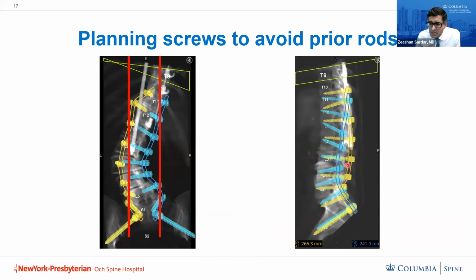That's because obviously there is rotation in the lumbar spine. And like I said, in this older patient with the lumbar scoliosis and a bit of a remnant thoracic scoliosis, I wasn't planning on completely derotating the spine or completely correcting the lumbar scoliosis. So I did have to plan for a different contour of the rods as well.